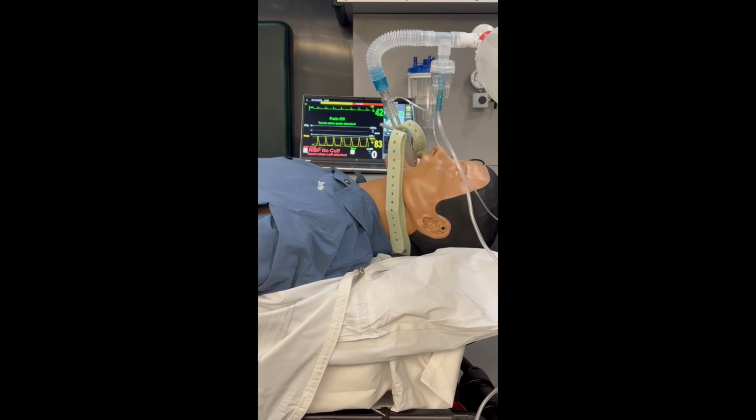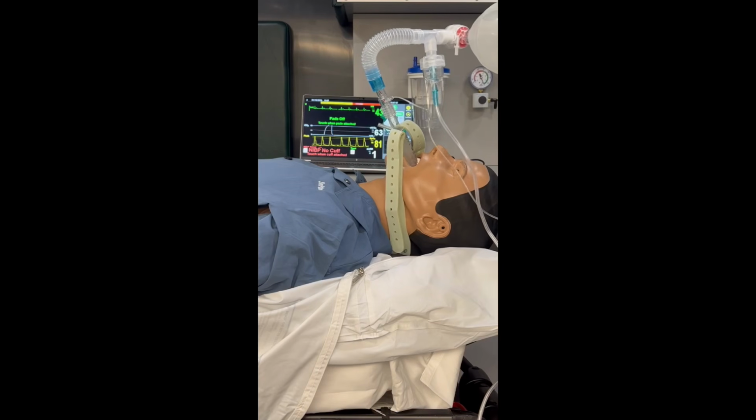Now we see the patient being ventilated through an inline nebulizer setup. The BVM is connected to the nebulizer and through corrugated tubing attached to capnography and the advanced airway.